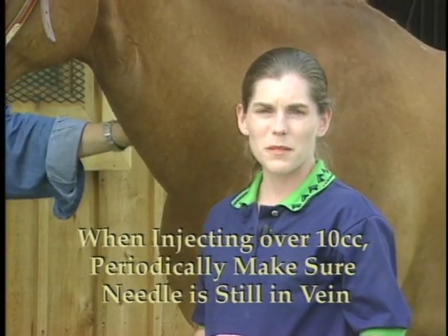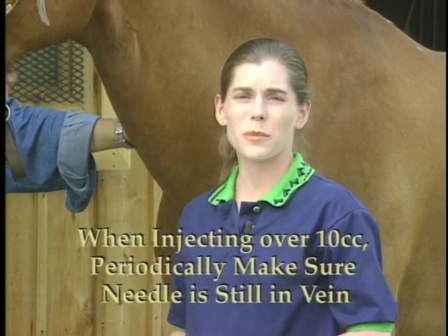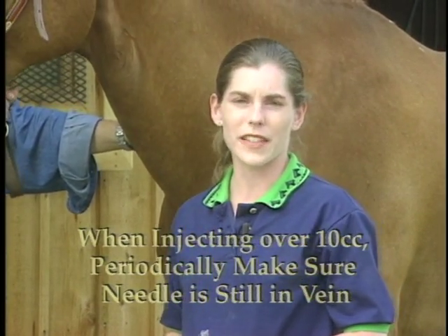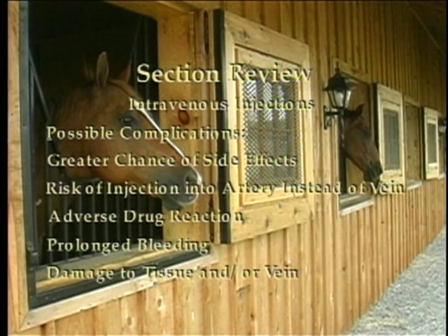If you don't get blood back, hold off the vein again and reposition the needle. This can be done without removing the needle entirely from the skin. When giving an intravenous injection, beware of possible complications if the injection is done incorrectly. Dangers include a greater chance of side effects, risk of injection into an artery instead of a vein, and risk of an adverse drug reaction and prolonged bleeding.